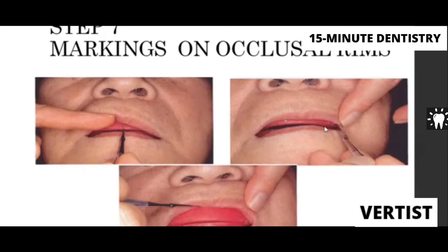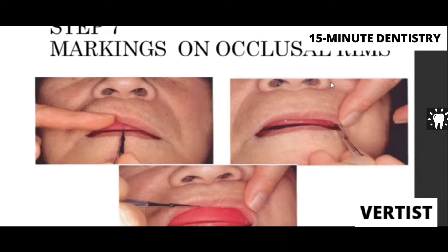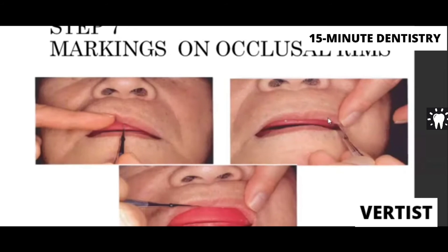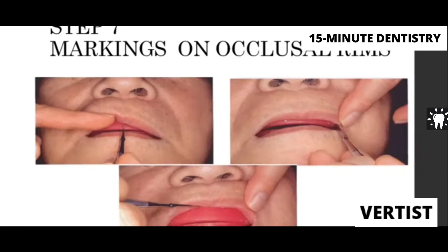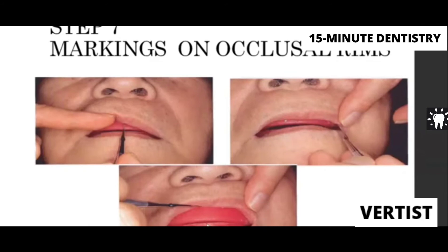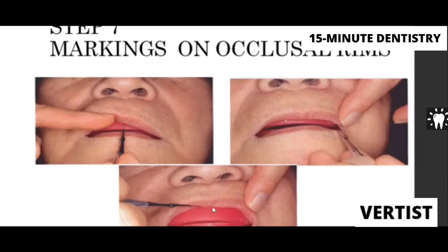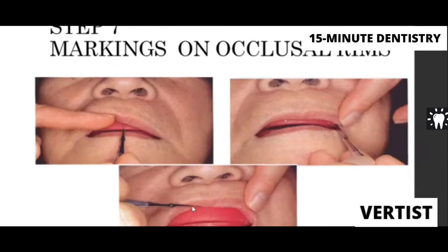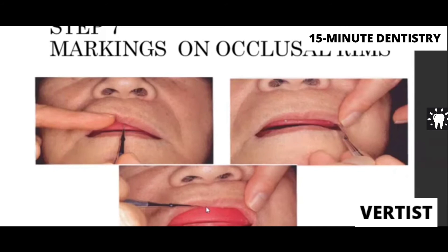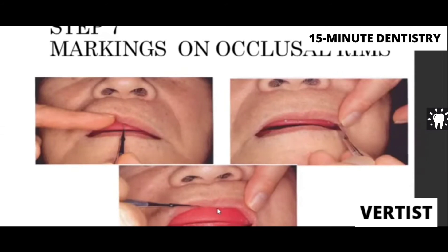Another line to mark is the canine line, and then the high lip line. The canine line is in line with the ala of the nose going downward — it gives a rough estimate of the width of the teeth from canine to canine. The high lip line is obtained by asking the patient to smile; the lower border of the upper lip gives the high lip line, which helps in deciding the height of the teeth to be selected for the patient.